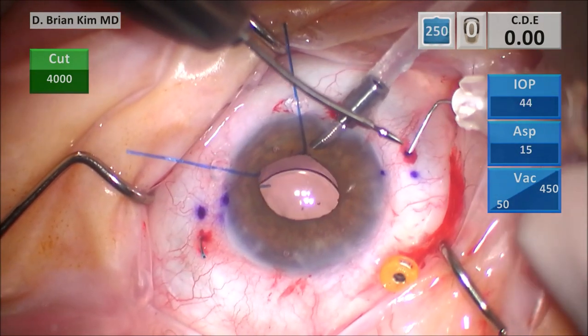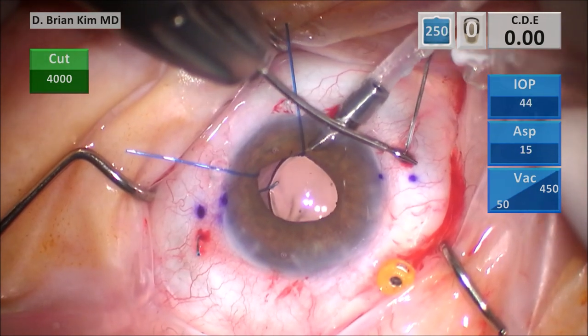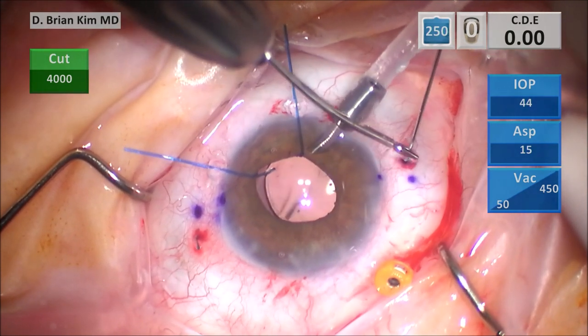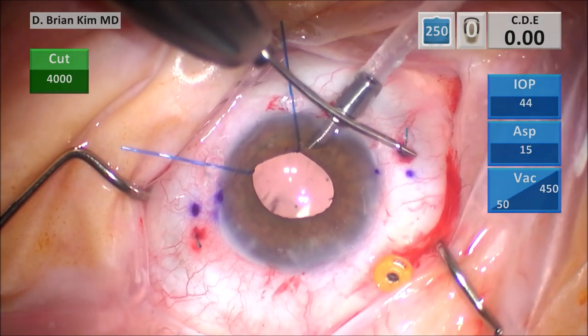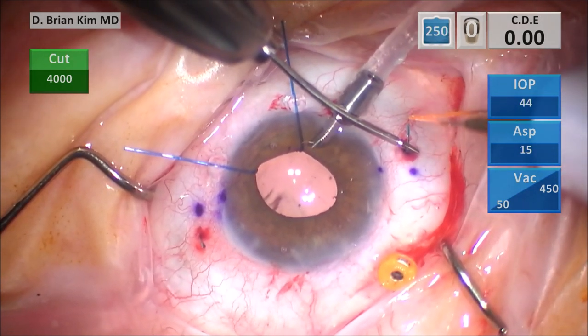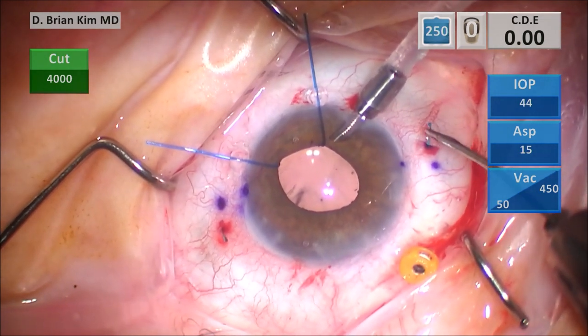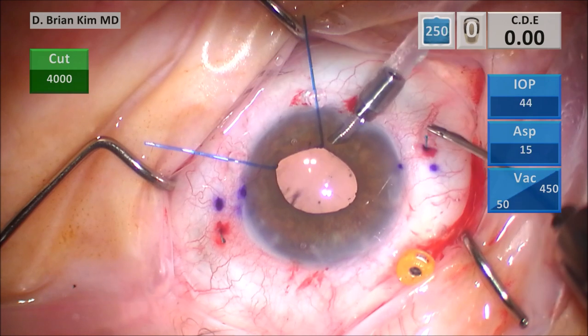Pay attention to how much tension there is on the left-side haptic-optic junction. You want to keep pushing that haptic in — you don't want it to come out too much as the right-side needle is coming out, otherwise it creates even more tension. You cauterize the tips, and that is the end of my modified Yamane technique. You can see that the lens is well-centered.